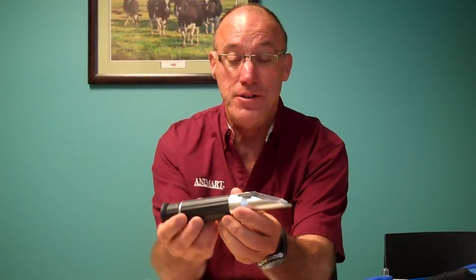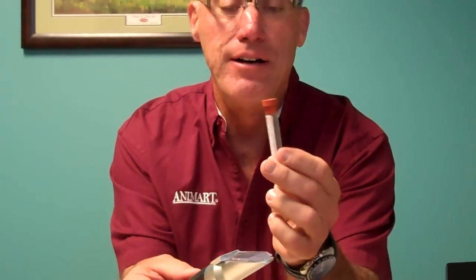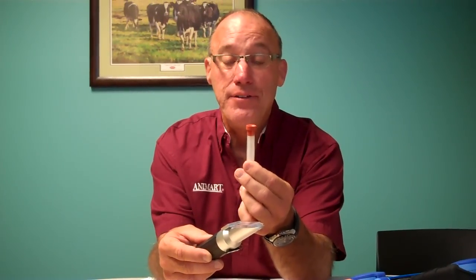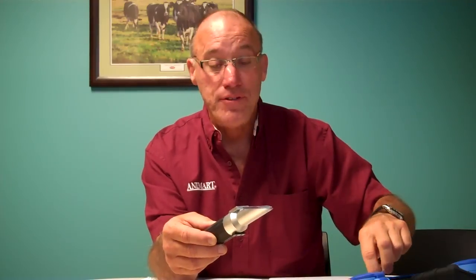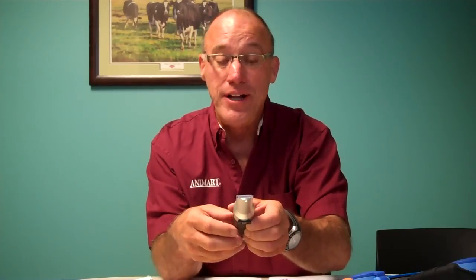For measuring total protein in a calf, we have used these traditional refractometers where you'd get some serum — you'd draw some blood out of the calf and put it in a tube like this, and once it clots and retracts you would draw some serum out and put a drop on here, then look through it and measure the total protein. Time consuming, hard to train, and probably not as accurate as what we have now.